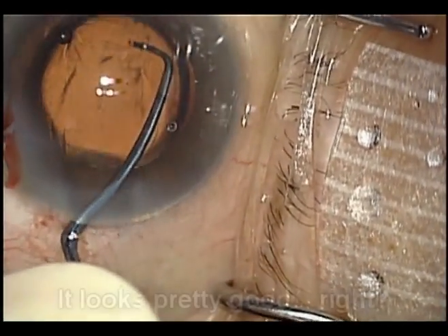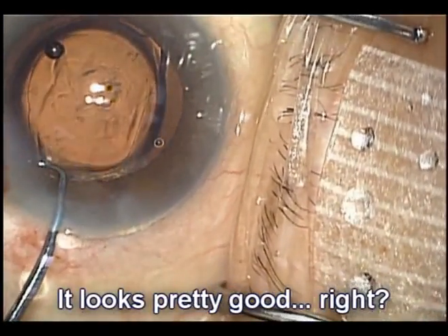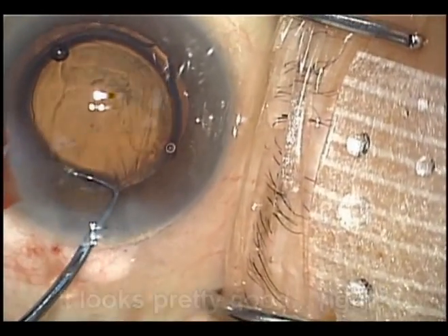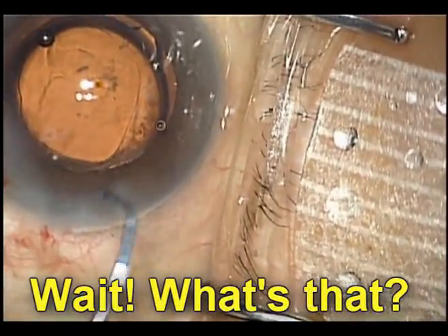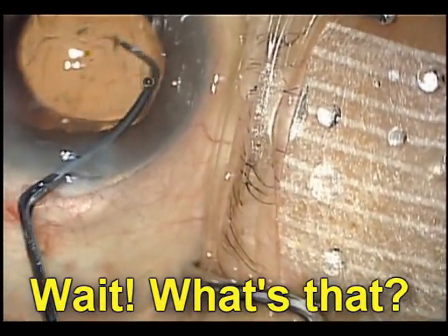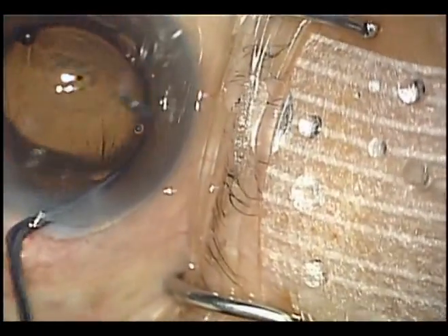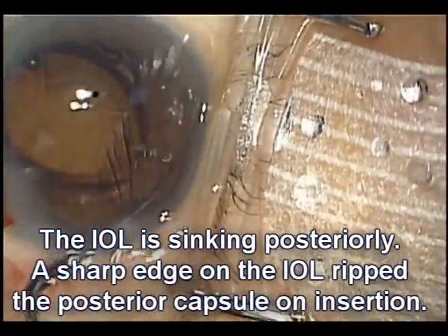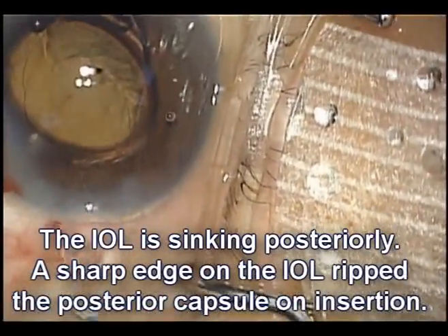Watch carefully. As we look at the lens, it looks pretty good behind the rhexis. But what is that? The lens is now descending posteriorly. The posterior capsule is wide open. A sharp edge on this lens ripped the posterior capsule on insertion.